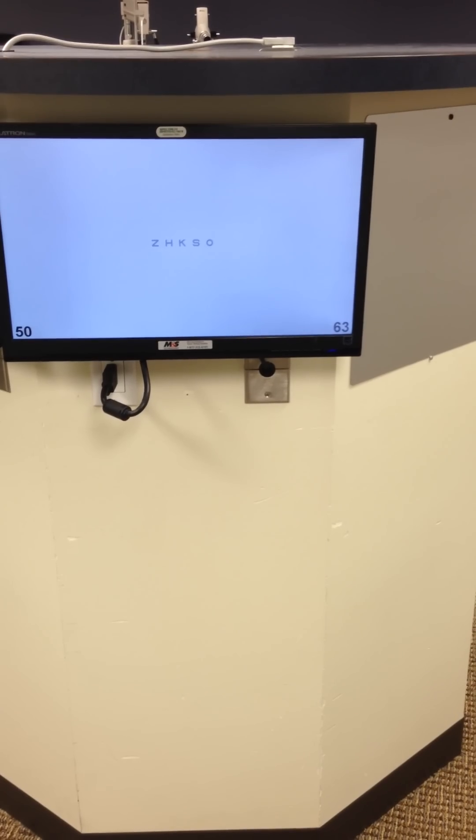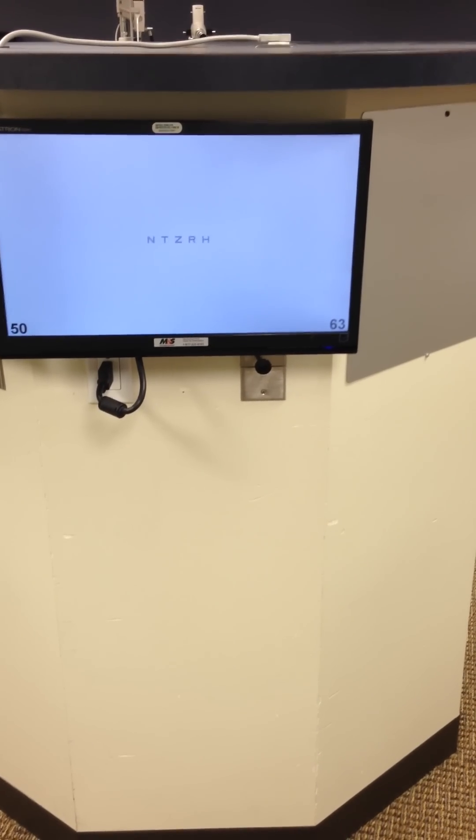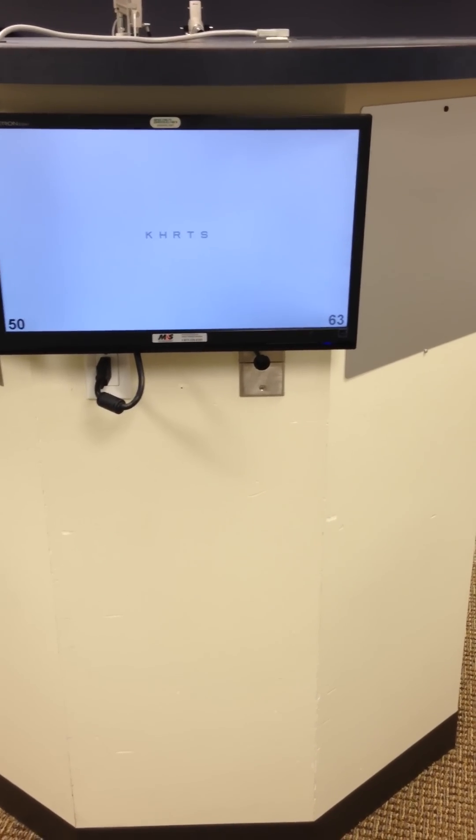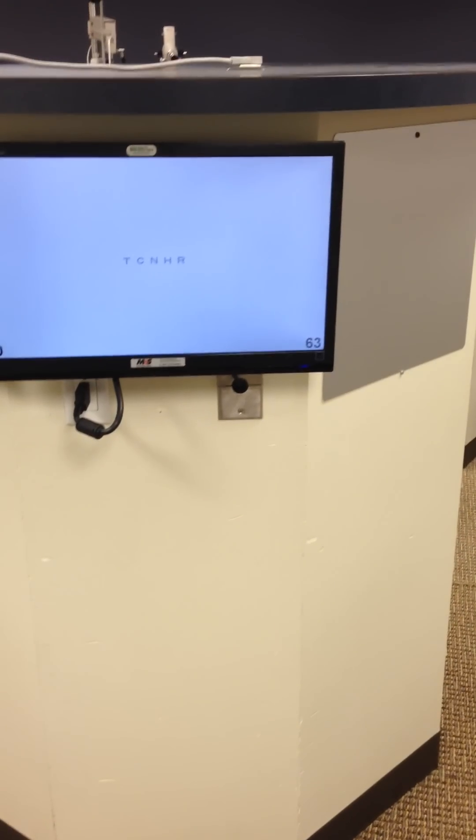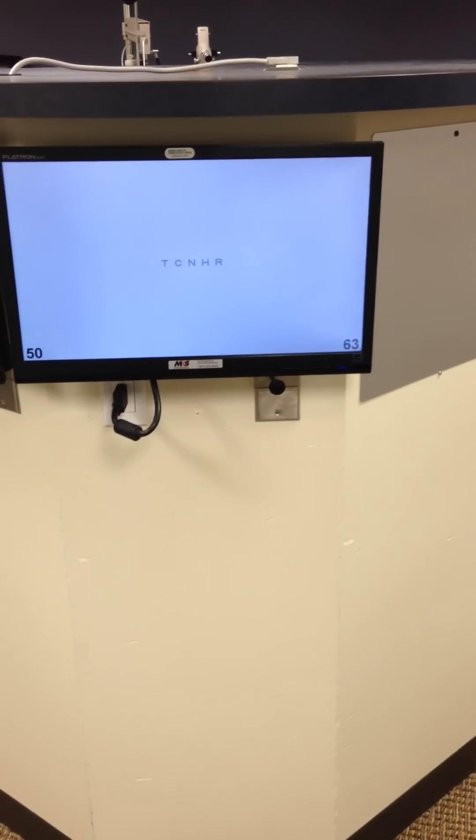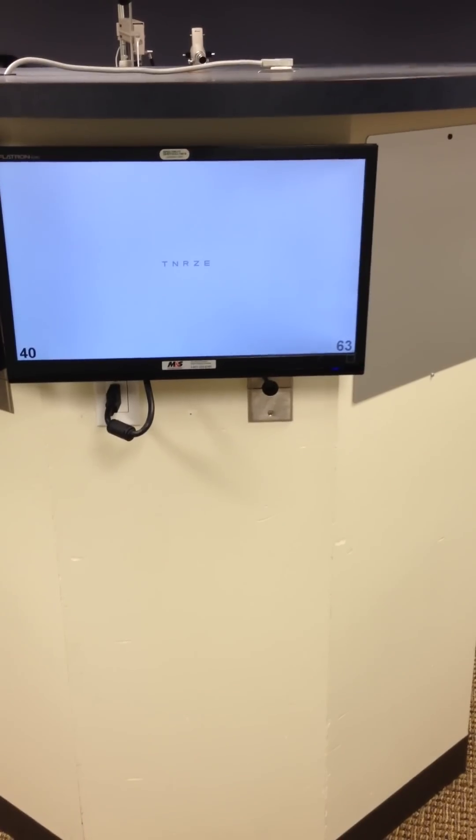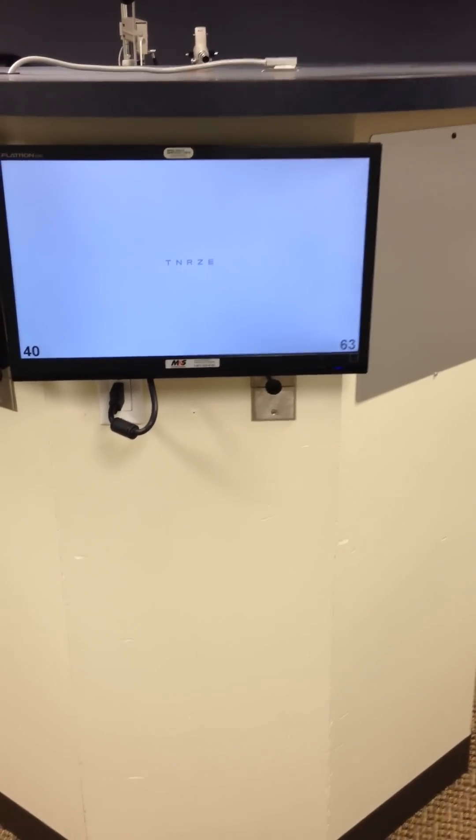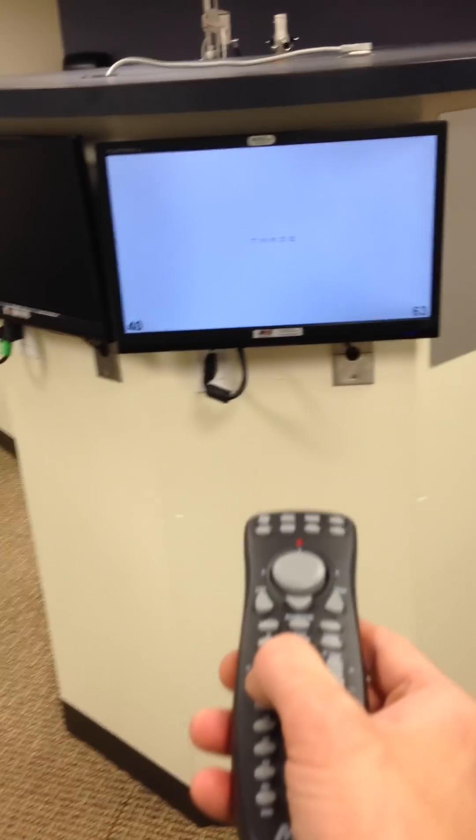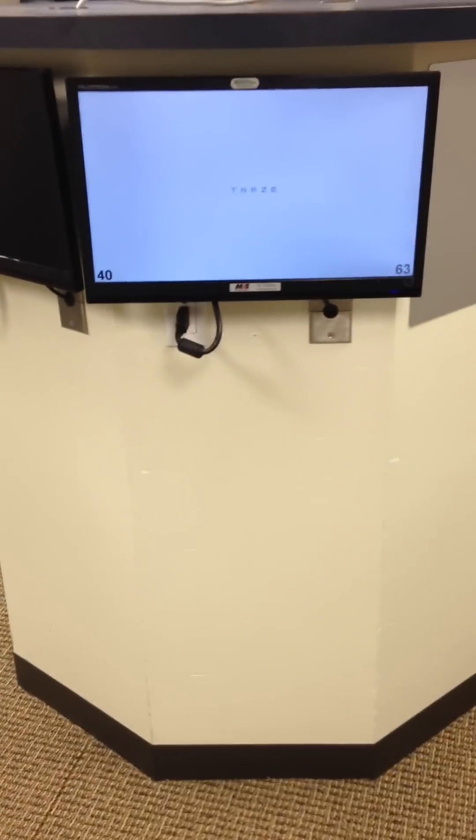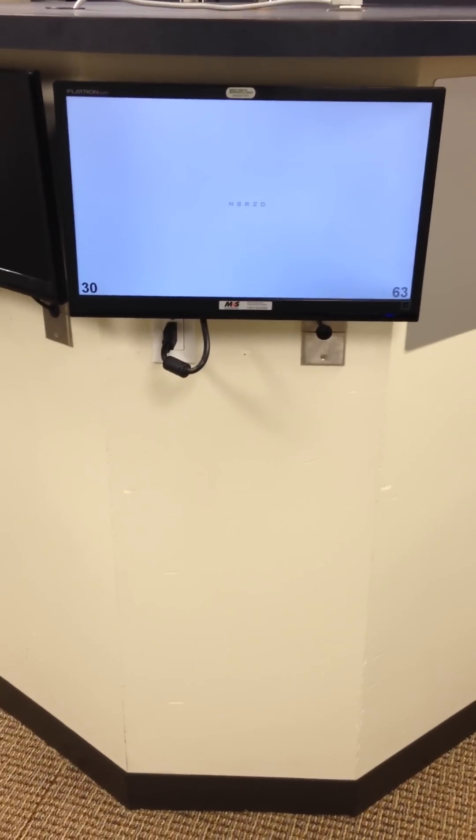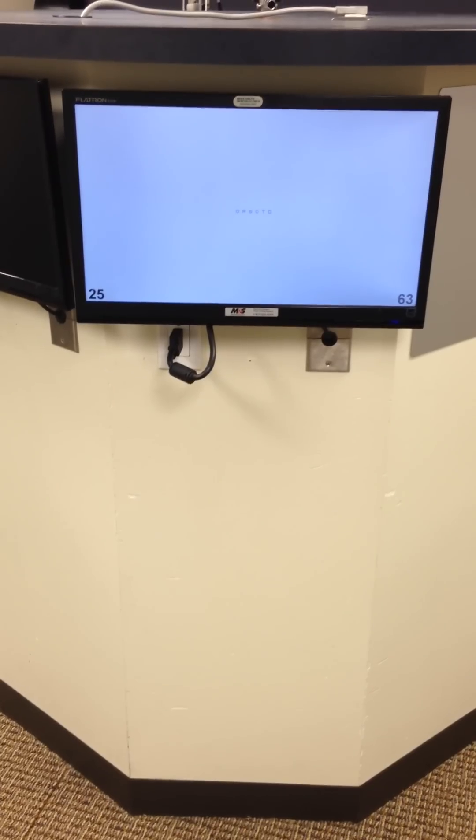And if I continue to hit that button, it will randomize them, just the contrast button. If I hit the down arrow on the remote, it will change from 20/50 to 20/40, and 30 and 25.